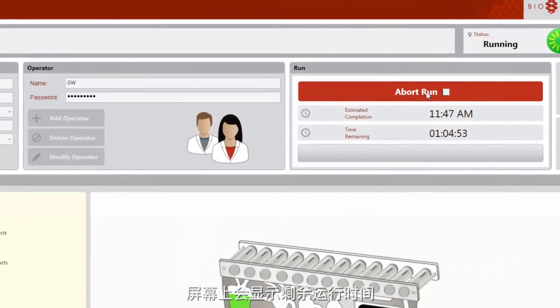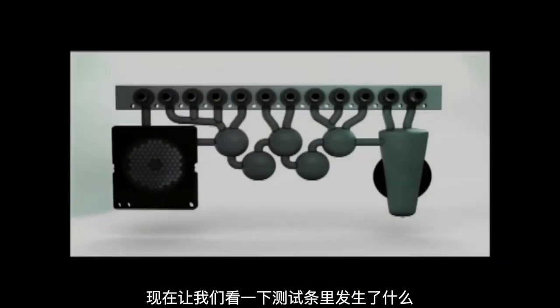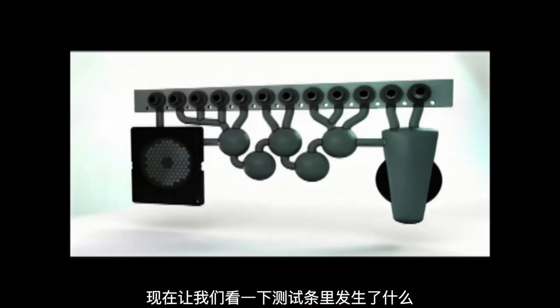The FilmArray displays the remaining time. Now let's take a look at what happens inside the pouch.